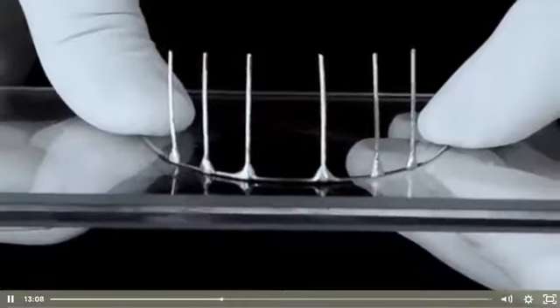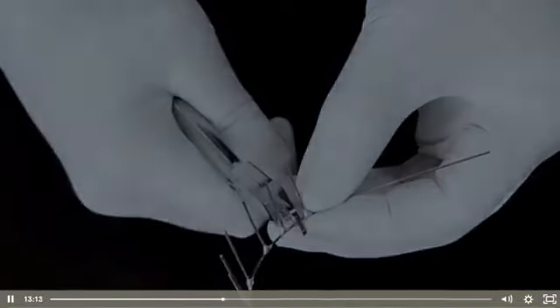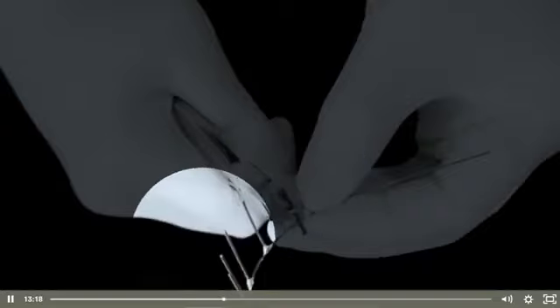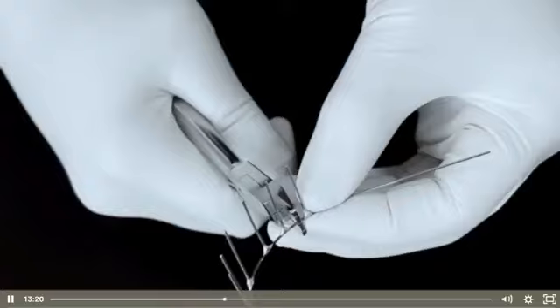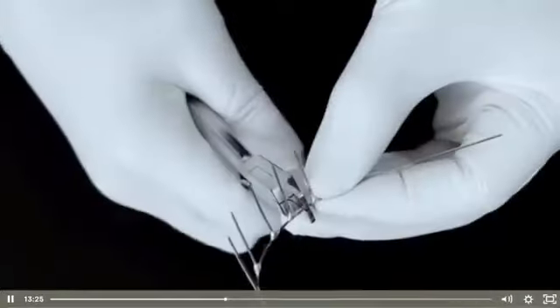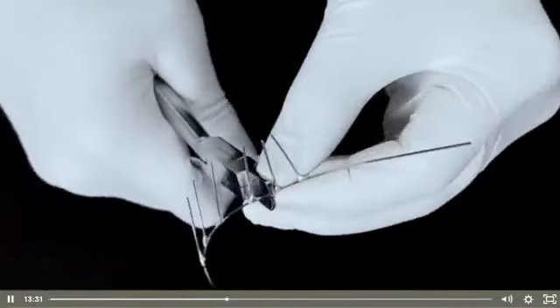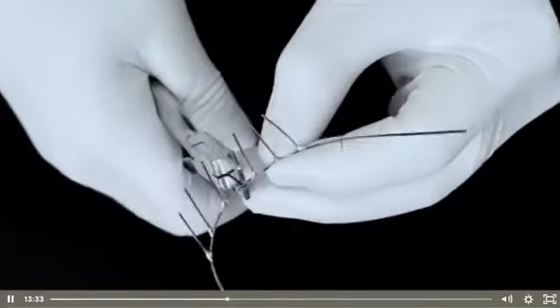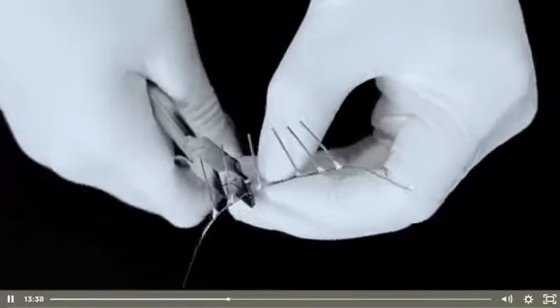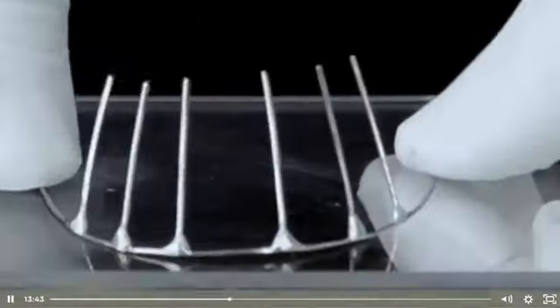Look at this. From one part, like from lateral, think about these strips here as the lateral incisor, central incisor, and canine. So we have six strips here that are showing this. Let's do it again. Look at this. We have a little twisting, rolling the wire, the wrist, and I'm going with my two fingers closer and closer to the pliers each time I do this type of movement. So I'm doing the torsion of the anterior segment.